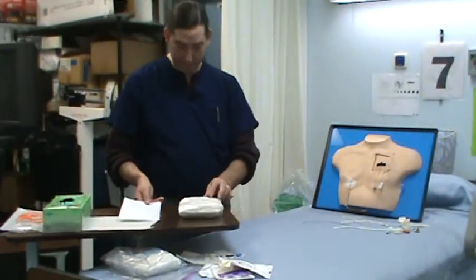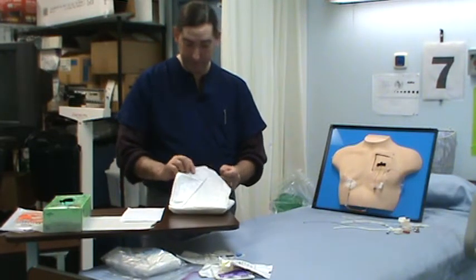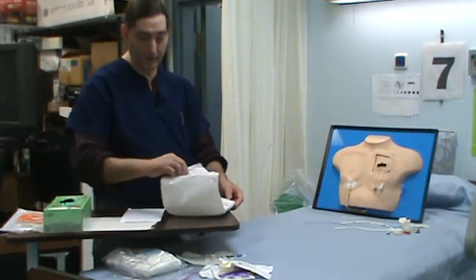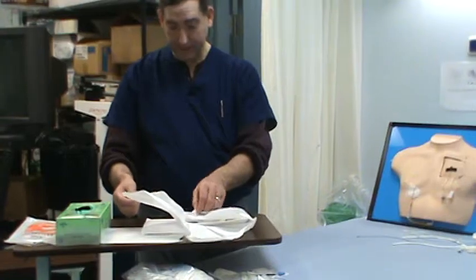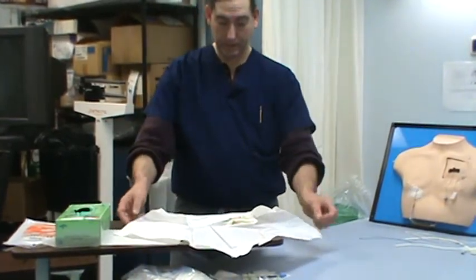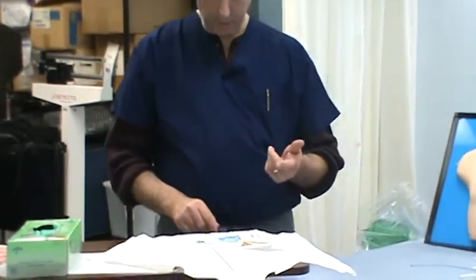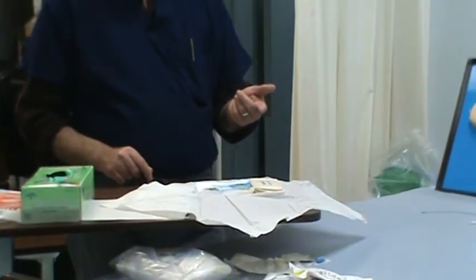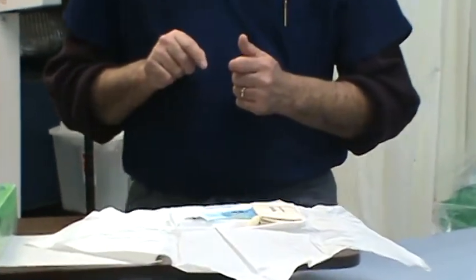I'm going to open my kit, and as you're always opening your kit, you're always making a sterile field. I'm always opening the first one away, then the other two to the sides, and the last one pulling down towards myself. Now they do have gloves in here, but once again, I am allergic. All I want to get off this kit is my mask. I don't want to put on my sterile gloves before I grab that mask, because when I put it on, I'll contaminate my gloves.